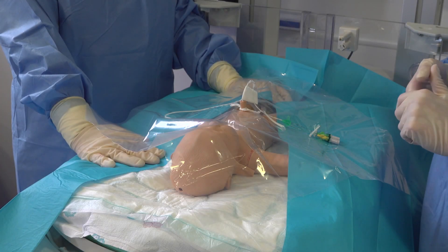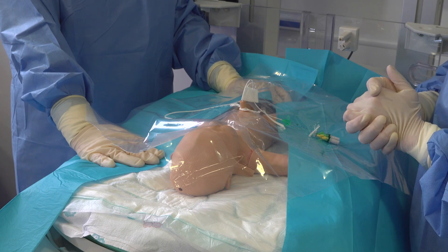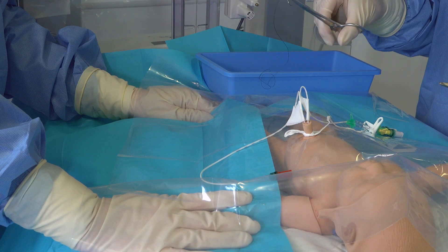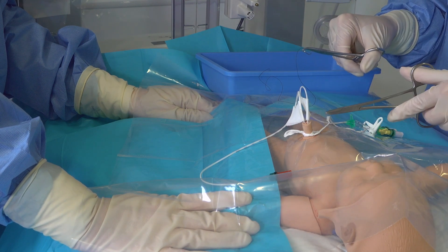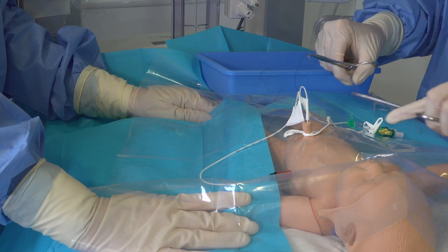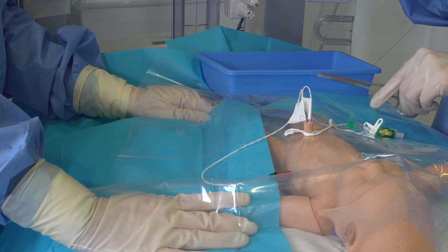In our unit we secure our lines using flag tape. We put one set of tape around each line with the base of the tape at the point at which you want it to be inserted. With your suturing equipment I find this is the easiest way to keep everything in place. With my forceps I grab my suturing needle and with my other forceps I ensure that I hold my cord in place. When identifying a correct place to put your suture in, ensure you do not hit either the UAC, the UVC, or the other artery that you haven't inserted. Generally I pick to the side of the vein and pull through just towards the end.